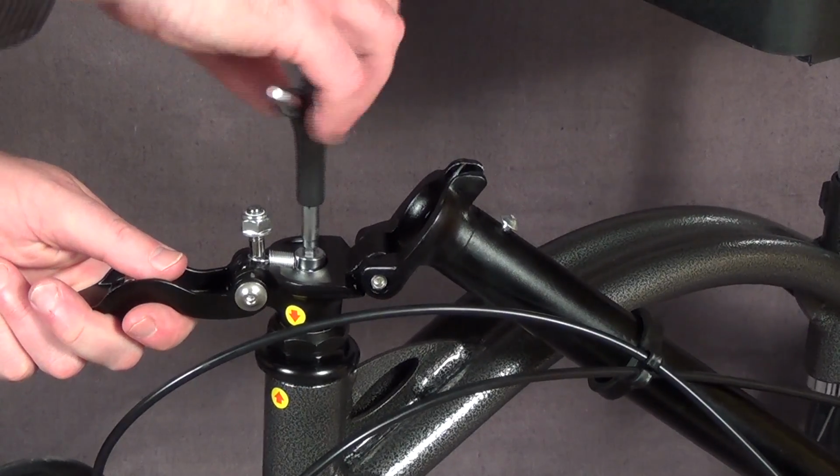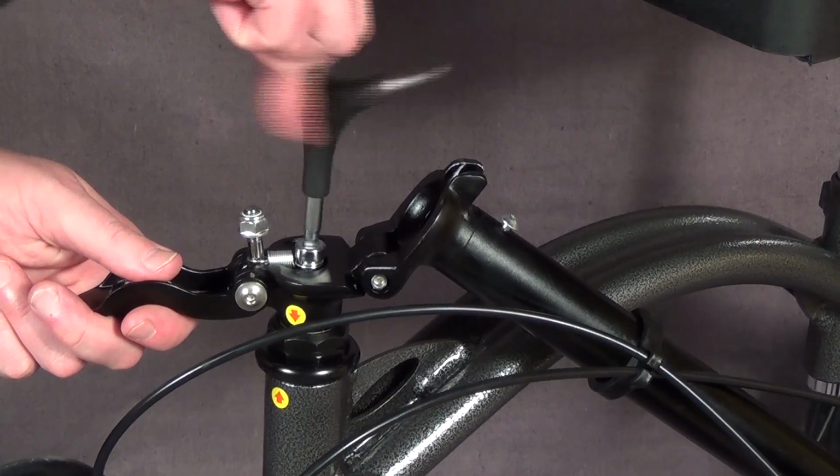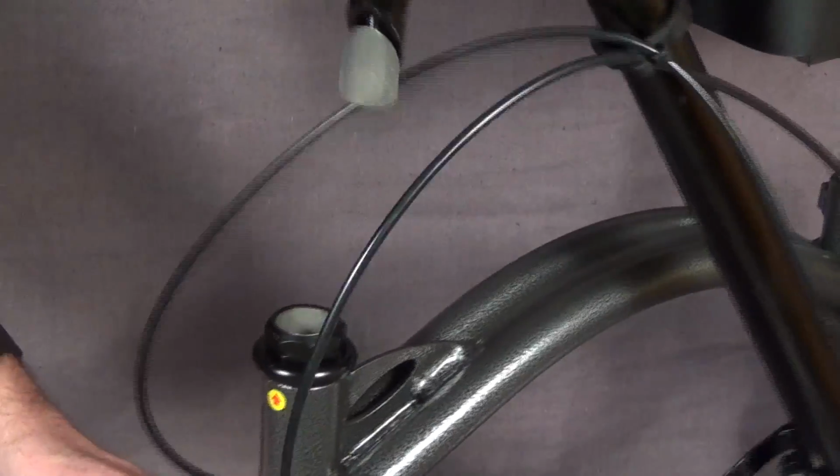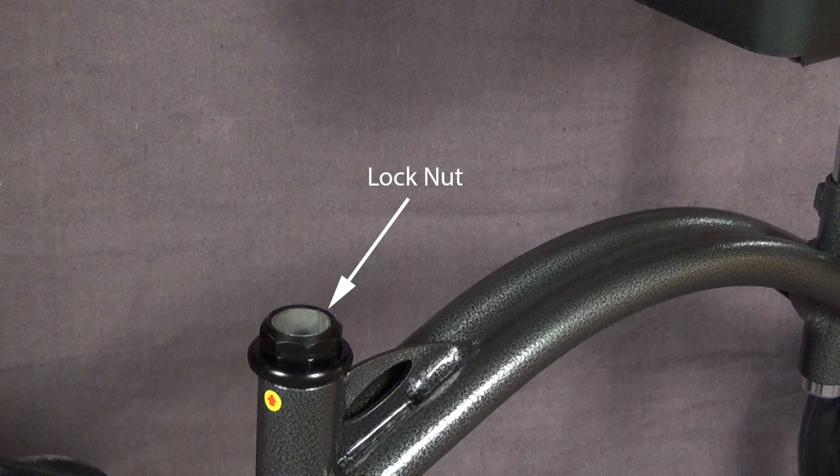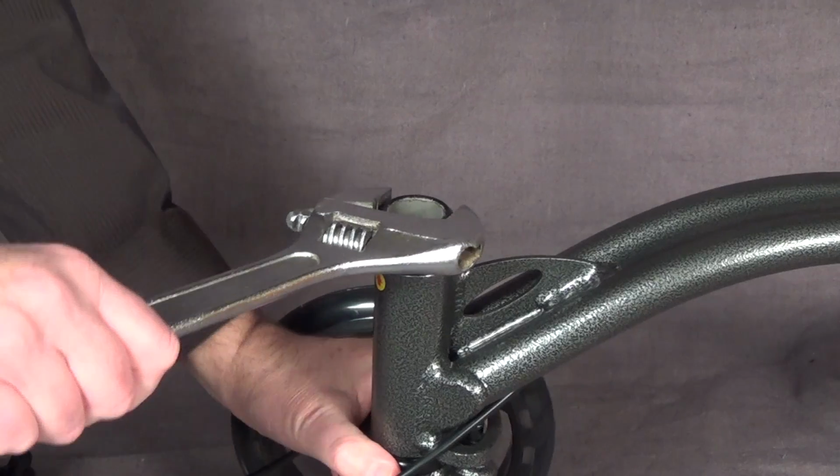Use a 6mm hex key to loosen the steering column. Remove the steering column. Use a large adjustable wrench to remove the lock nut and the adjustable race from the frame.